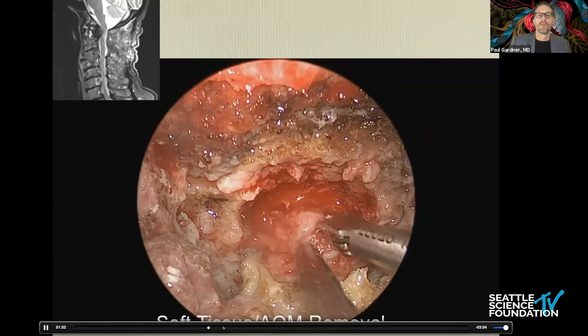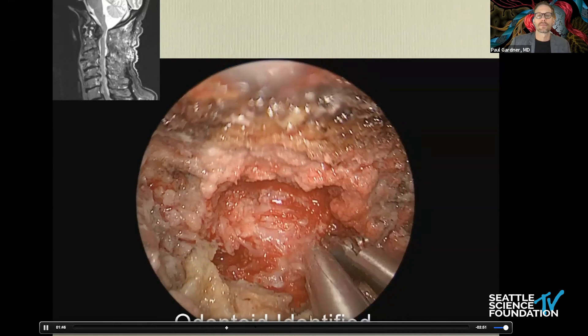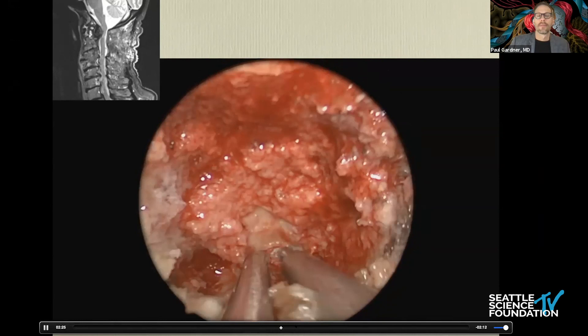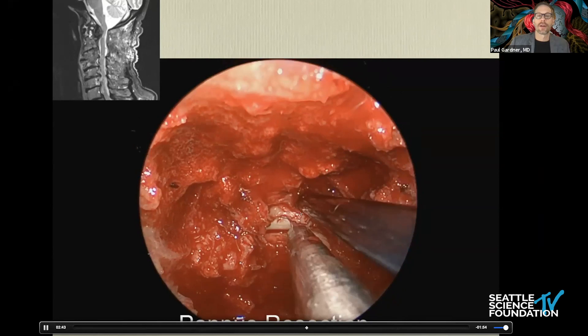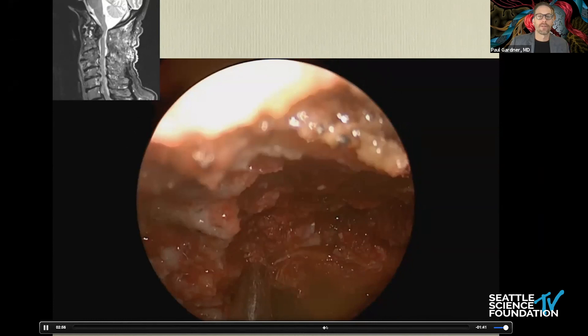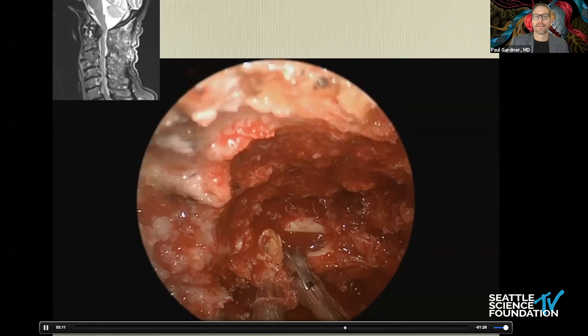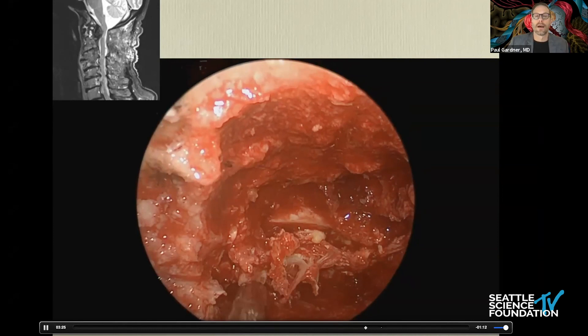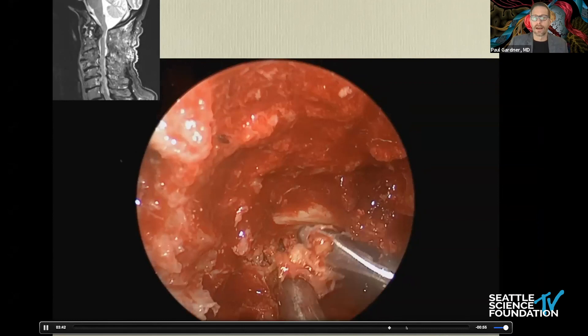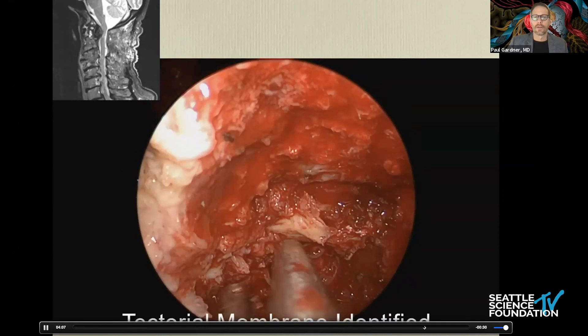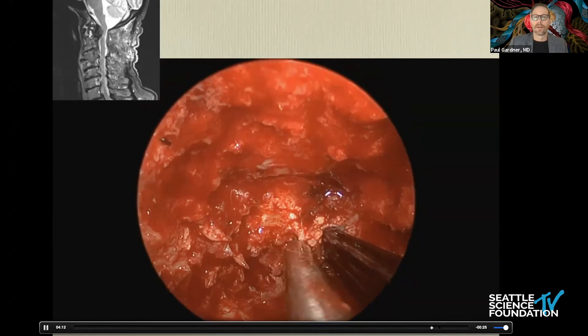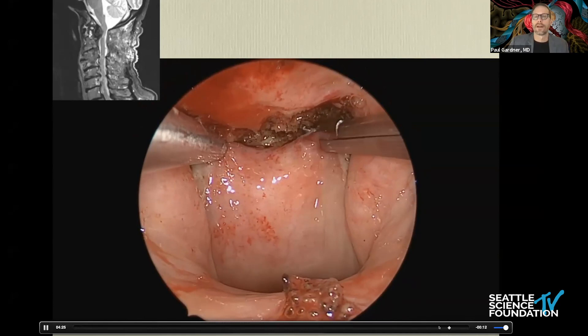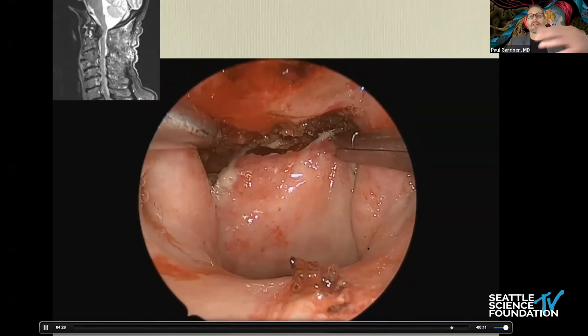Here I'm removing the soft tissue and joint capsule around C2 and the dens. Then I can identify the odontoid and drill it down. Once removed, now I can deal with all this pannus. You can see a bit of the transverse ligament after removing that. Once I open and resect the transverse ligament, I have almost nothing but this thick calcified pannus. The ligaments become much more difficult to distinguish — they essentially turn into a combination of calcified and granular tissue. You do have to recognize that's the transverse ligament being resected. Once we reach the tectorial membrane — this is not dura, you don't have to expose dura, just the tectorial membrane.